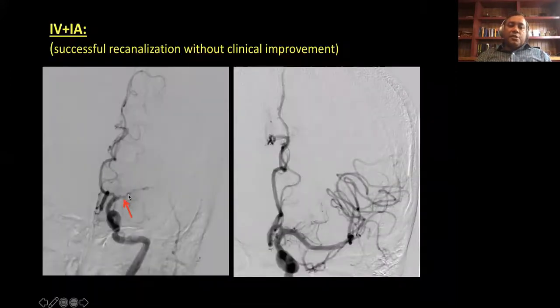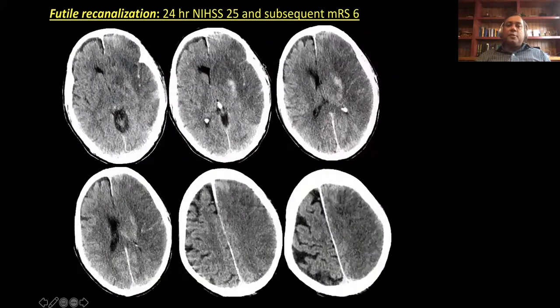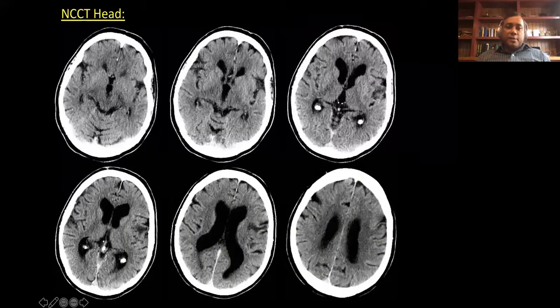Now, at that point, we were trying to see how patients with ASPECTS 5 or 6 would benefit. And so we took this patient to endovascular thrombectomy after giving intravenous thrombolysis. The patient still had the occlusion. The patient did recanalize, as you can see, really well. However, this is what happened. Patient didn't do well. Had a big stroke because of the poor collaterals and then died. So, imaging helps in assessment, right?